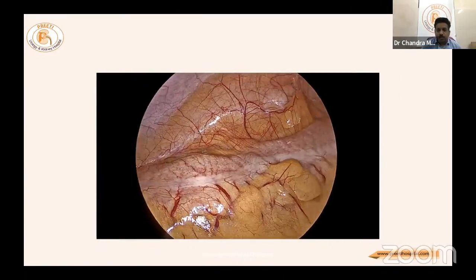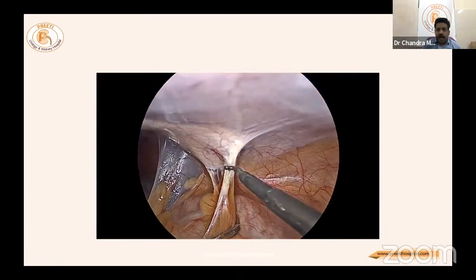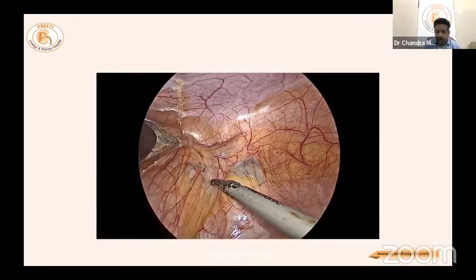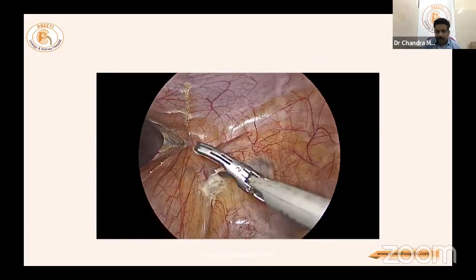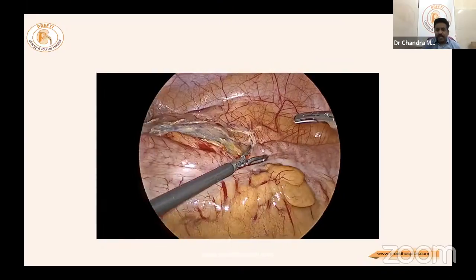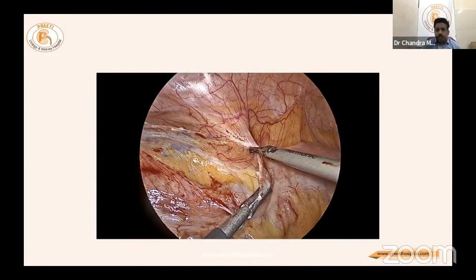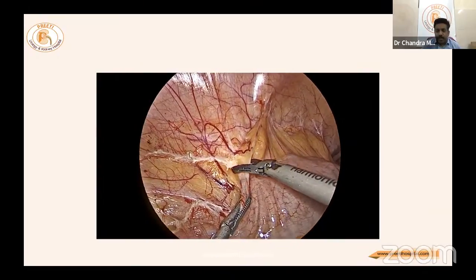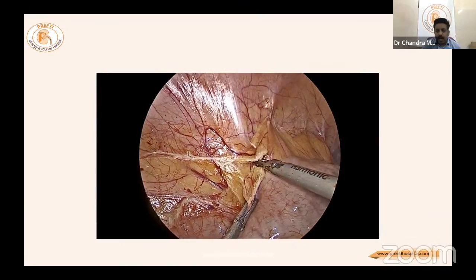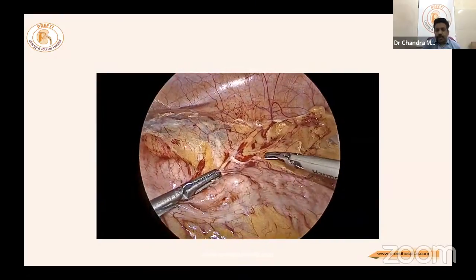The video demonstrates initial dissection using a hook, though the surgeon is now more comfortable with harmonic. Complete mobilization of the colon is essential. On the left side, dropping the spleen and all its attachments — including splenic vein, splenic artery, pancreas, colon, and sometimes stomach — is the most important step.